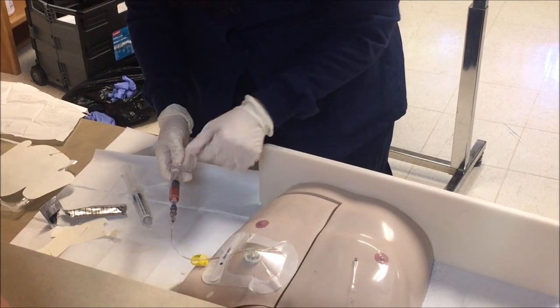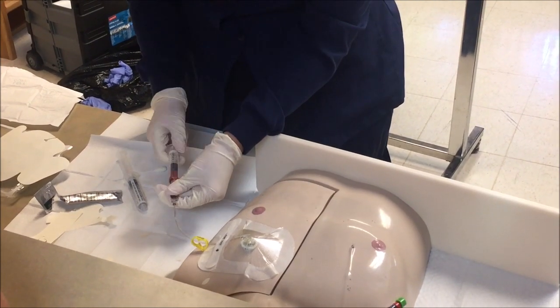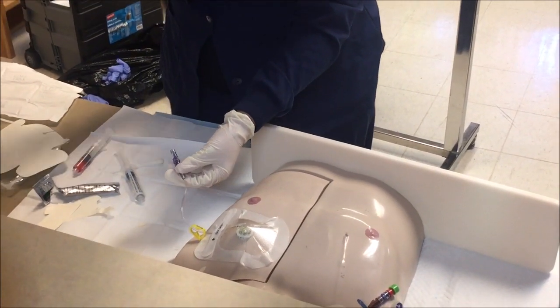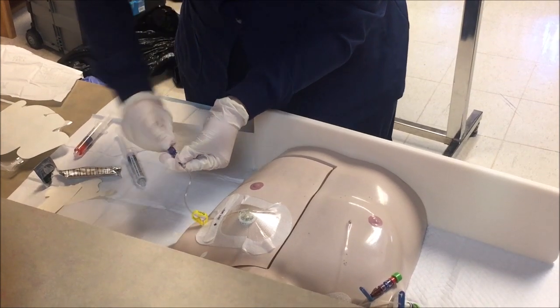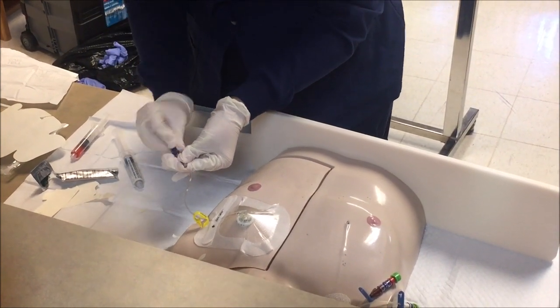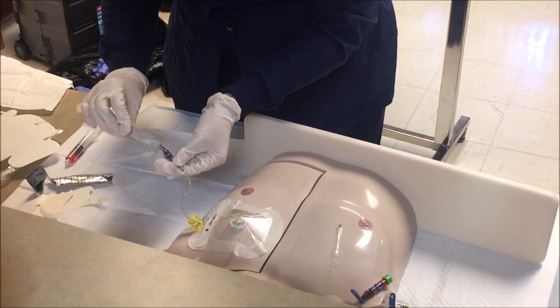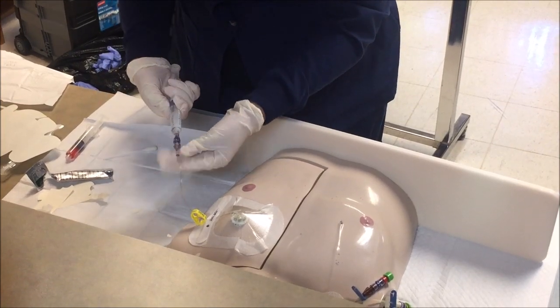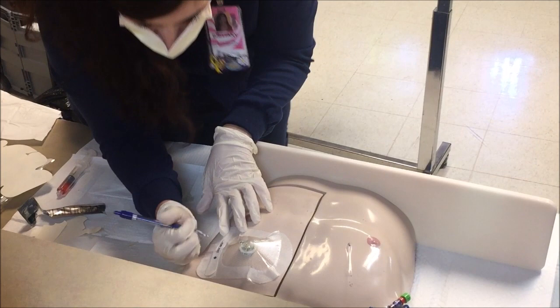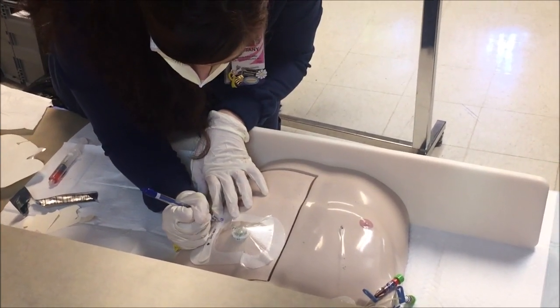Now that the dressing is in place, it's time to confirm placement. Slightly pull back on the syringe, aspirating for a brisk blood return to confirm patency. Clamp the extension tubing and remove the syringe to discard the blood — do not flush into the catheter. Place a needleless injection cap onto the extension tubing and use a turbulent flush method to flush the venous access device with 20 ml of normal saline. Observe the skin surrounding the non-coring needle for leakage of fluid or infiltration to the access device.